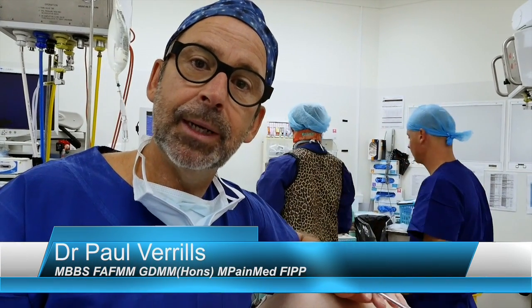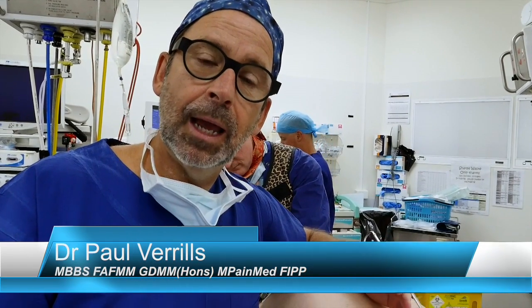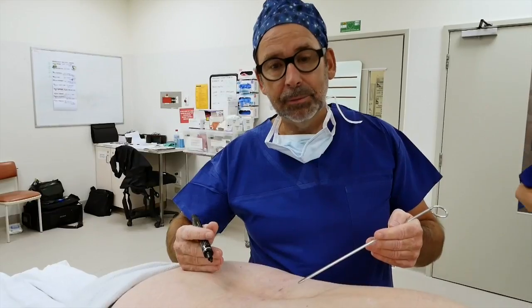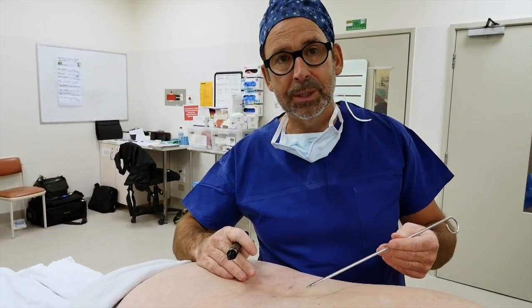I'm now going to show you how we mark up a patient immediately before the spinal cord stimulator implant and before we actually do our scrub and prep. I'm going to be demonstrating a spinal cord stimulator implant using the Nevro High Frequency 10 system.